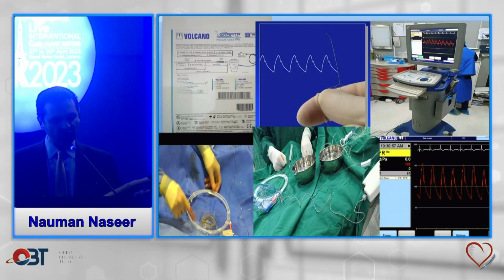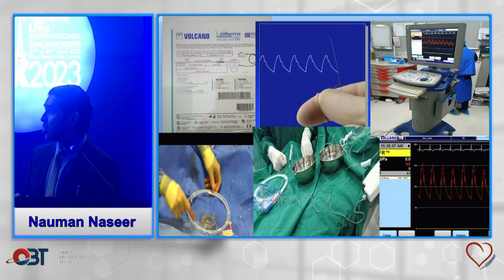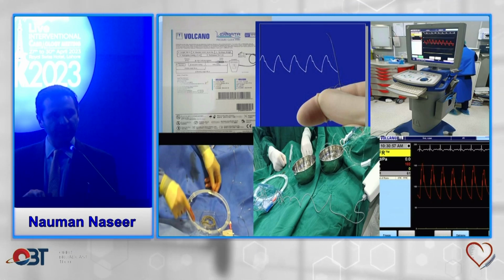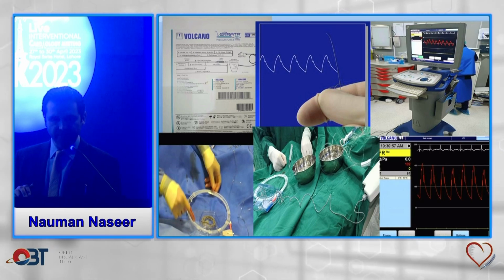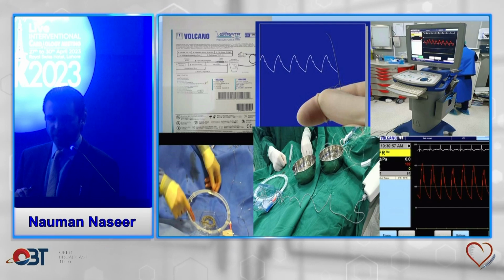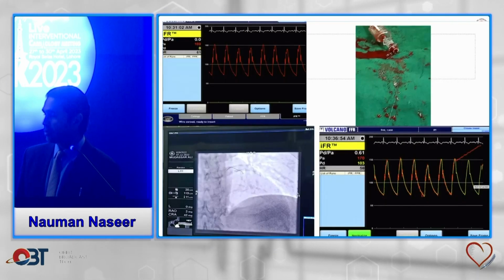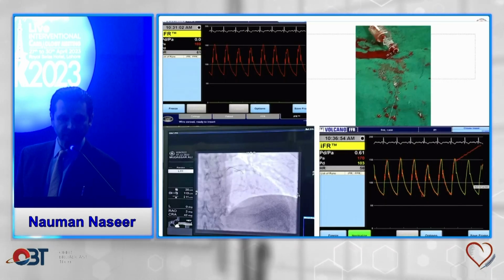And this is what comes out of the packaging, the plastic tubing. You put it down on the table, flush that plastic tubing, let it sit there for 60 seconds, then hand over this cable, plug it in to the console, and the machine will start saying by itself, wait for zeroing. Sometimes you press the 0 button, but over here in this console, it says wait for zeroing. Then it will say zeroed and ready to insert.